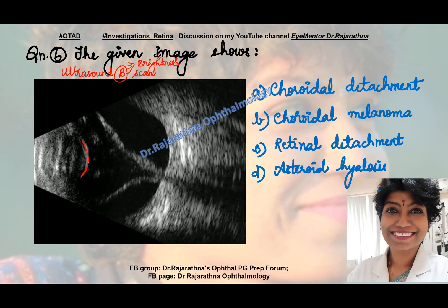All that I can see is the posterior surface of the lens. And this shadow that you see here is that of the optic nerve. Something is arising from the optic nerve, taut and going into the vitreous. So this is probably a retinal detachment.